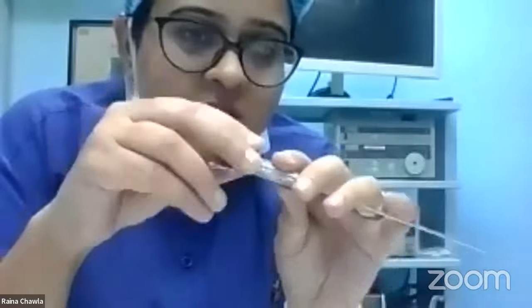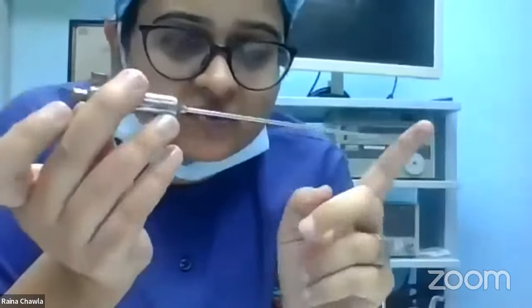So once you're sure you're in the cavity, you attach the tubing, switch on the gas, and let the pressure build up. Okay. So once the intra-abdominal pressure is around 20 millimeters of mercury, then we put what is called our ports. A primary port through which the laparoscope will go. So what is a laparoscope?